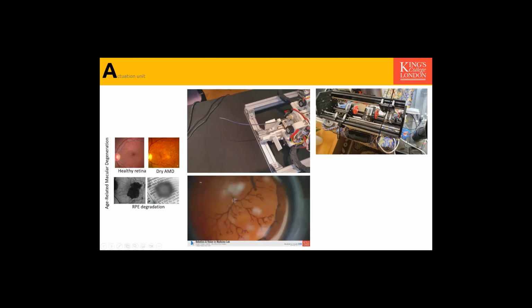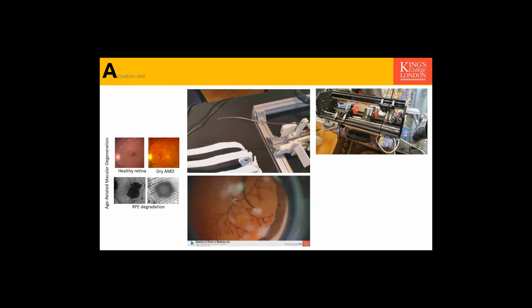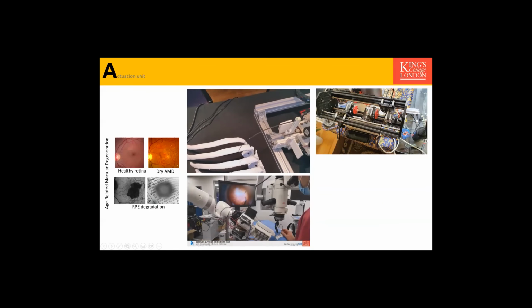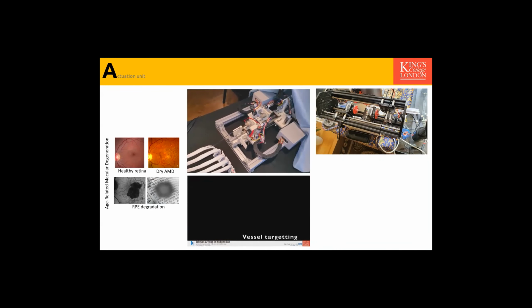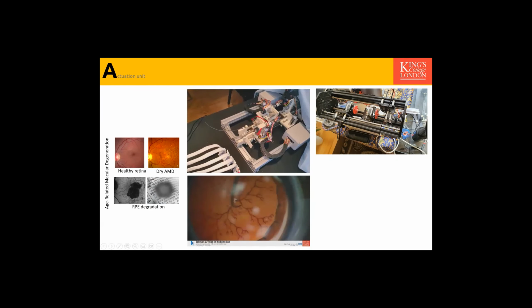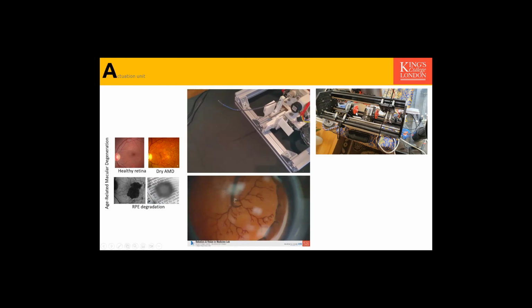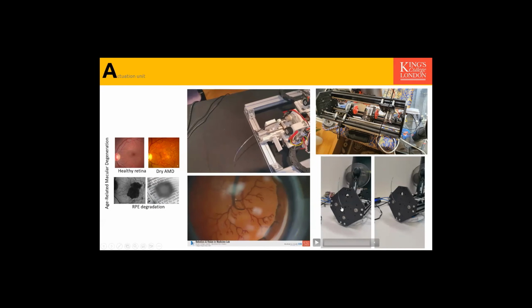the pandemic hit, so I wanted to put this picture here. It's messy, but it's basically my setup on our coffee table at our house during the pandemic. And this has a structure pretty much similar to one of the CTRs that, well, Jessica, you have at your lab. It's basically three linear actuation units with three hollow-shaft rotational actuation units, and you can steer three concentric tubes all together. You kind of see them in action here.